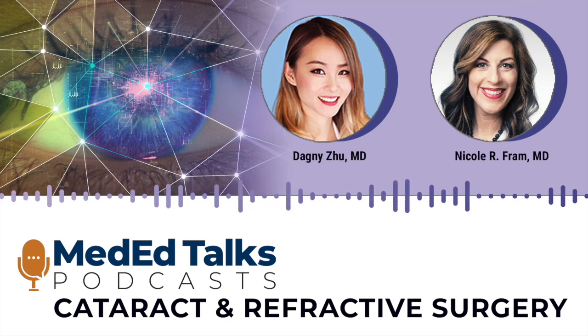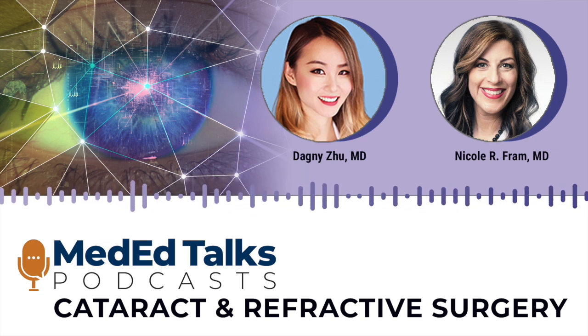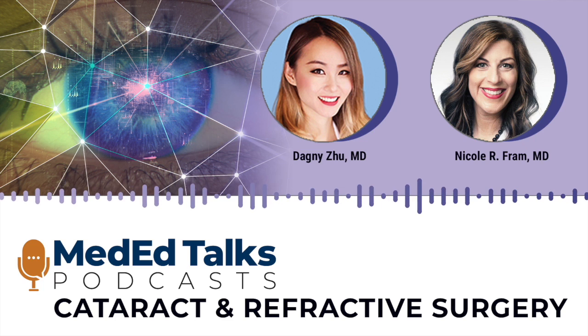So it's not a deal maker. It's a deal breaker. And so I go in, I say, this is what I'm willing to accept. If I have two biometers, typically I'll look at Barrett, Hill-RBF. I like to use an AI-based formula and a Vergence formula. I look at both of them, and the Kane is also great. And I say to myself, okay, I'm in between two lenses. This is what I'm willing to accept. And if I do ORA and I see that it agrees with those two other formulas, I'm feeling really confident.